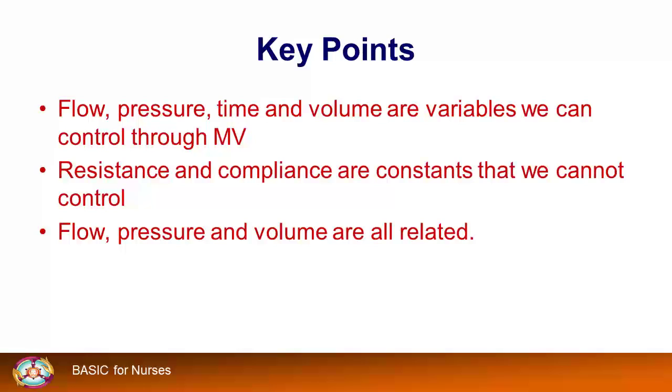Key points. Flow, pressure, time and volume are variables we can control through mechanical ventilation. Resistance and compliance are constants that we cannot control. Flow, pressure and volume are all related.